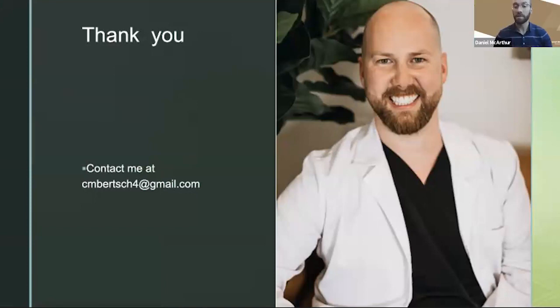Well, perfect. So thank you very much, Dr. Bertsch. Did a great job of explaining the processes of the reline. And one of the big advantages of doing the reline with the Simplus is that the patient gets to keep that denture. So they're not going a couple days without their denture, especially if you're living in a rural area where they don't like to come back and forth for that. So great option there. We'll open it up for question and answers.